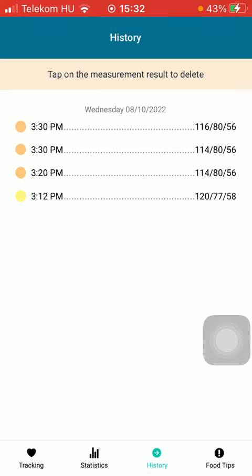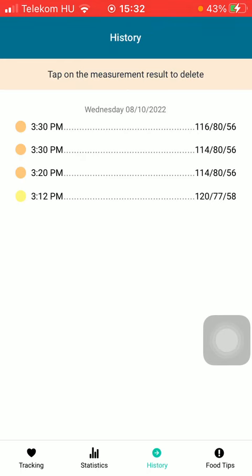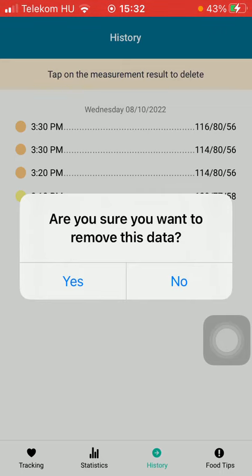If you would like any of them to be deleted, all you have to do is tap on it, then you need to tap on the button saying Yes.